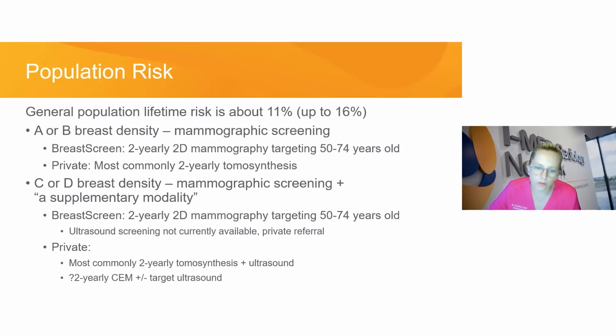I am a personal advocate for screening from 40, so I do recommend to women that they reach out to breast screen and start screening from 40. However, as you know, they'll be targeted from the age of 50 to 74. If a woman decided they did not want to go to breast screen and they presented to a private clinic, most commonly they would have tomosynthesis as their standard test rather than 2D mammography, and would be a recommended 2-year rescreen.